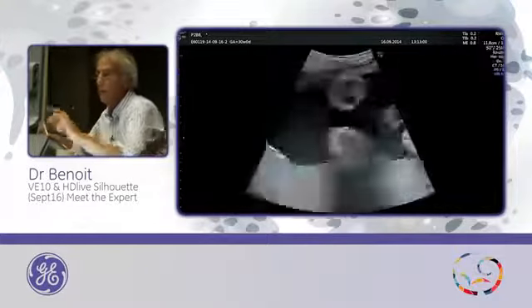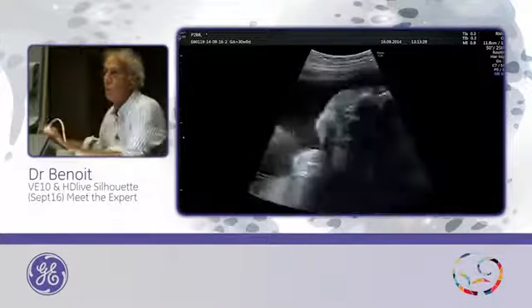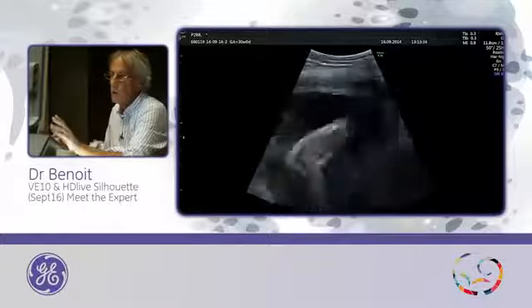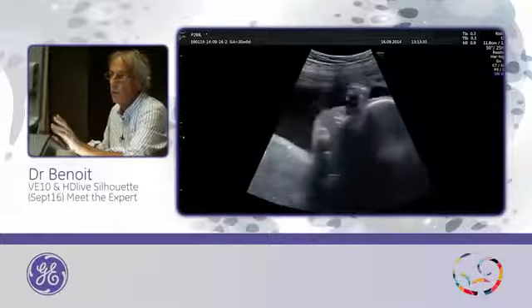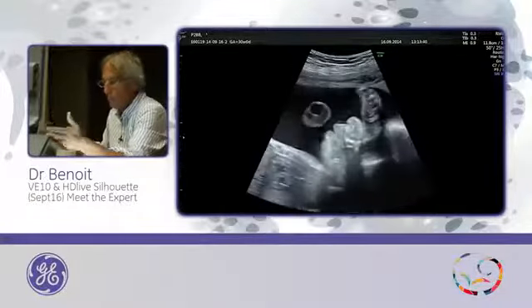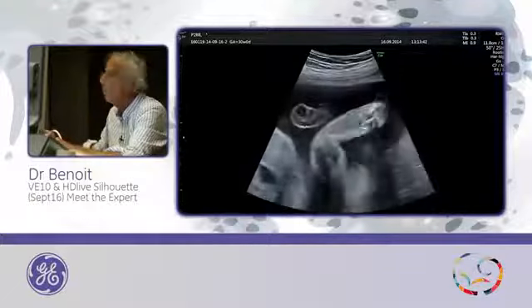So what I will do now, because I have no first trimester pregnancy, I will open some cases, especially in the first trimester of the pregnancy, and I will show you how to play with the silhouette.